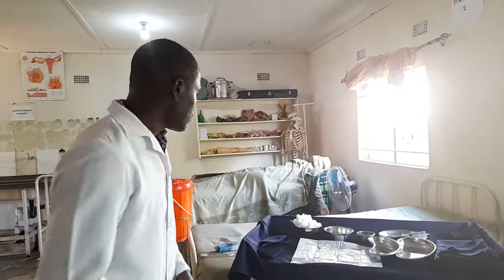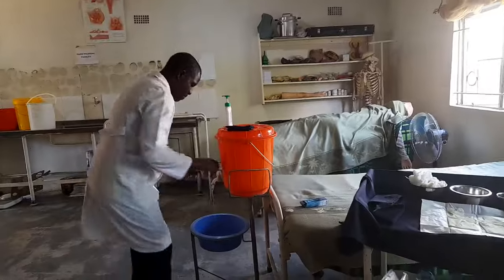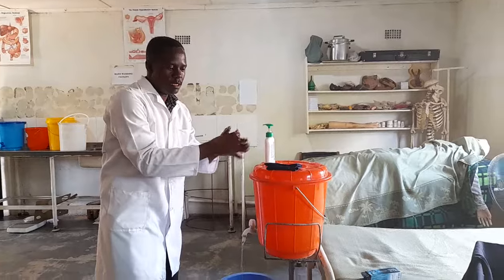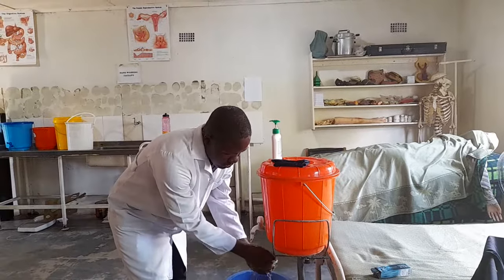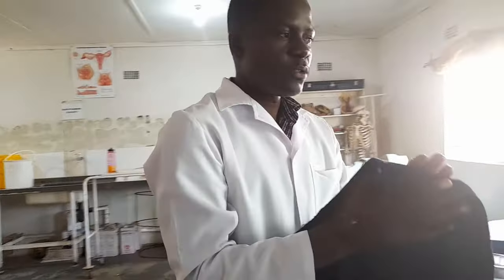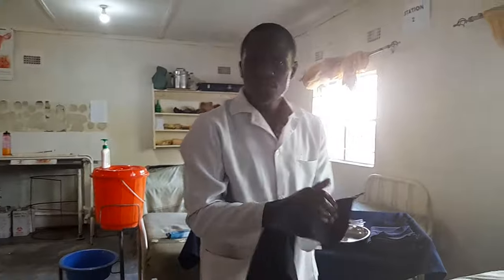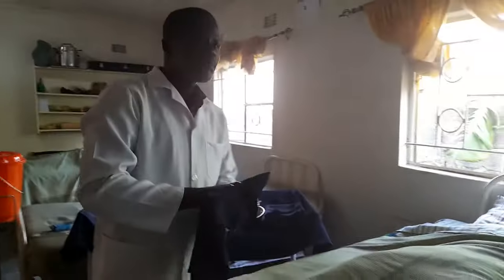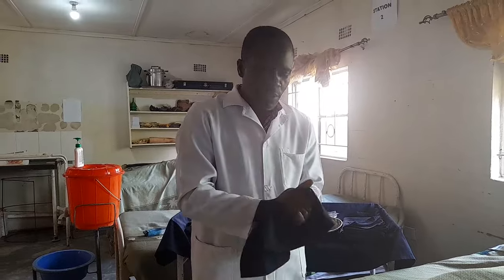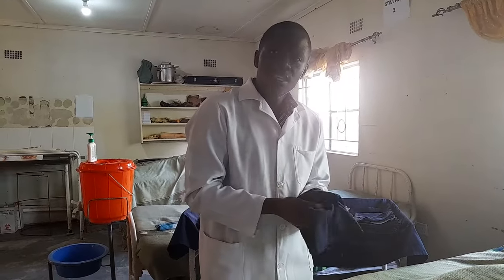We start with hand washing as usual. Start drying your hands. This is Mrs. Mwape. We start: 'Good afternoon Mrs. Mwape, I am student number two. I have come here to insert a catheter on you — may I please go ahead? Is there anything I can do for you before I begin?' She says nothing, thank you.